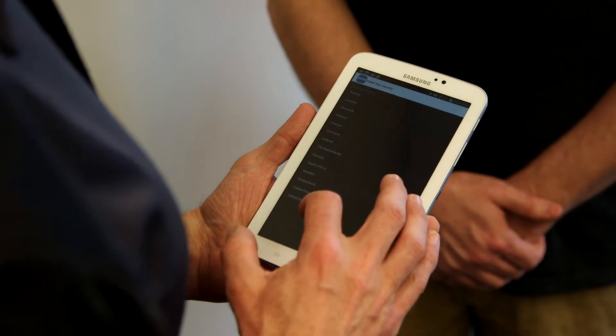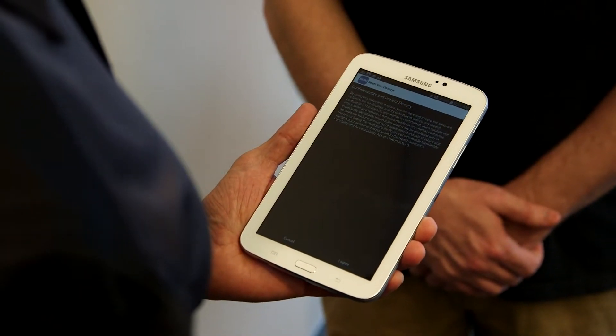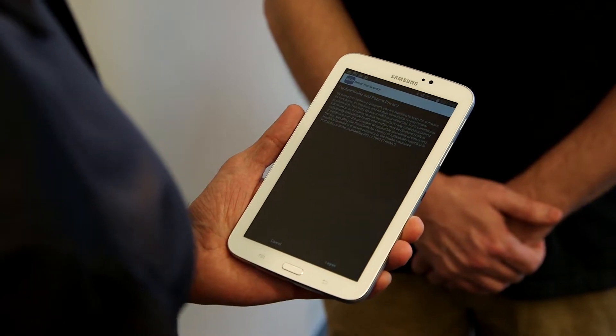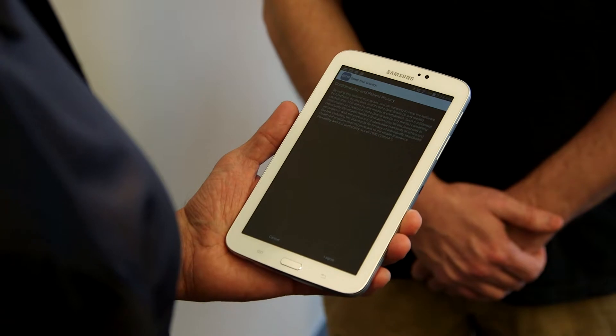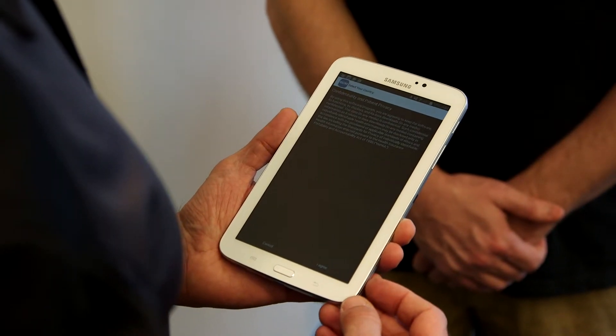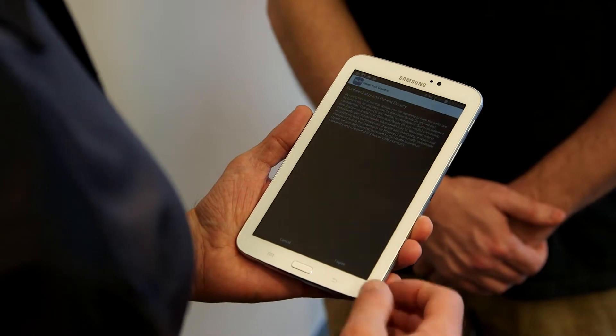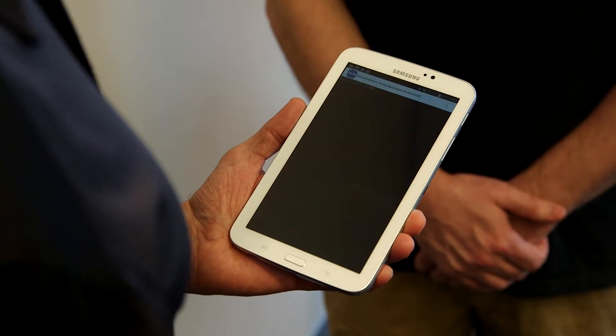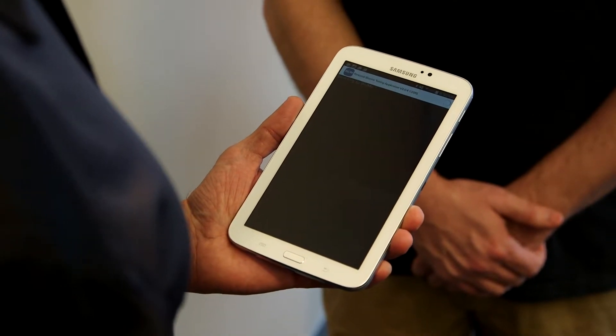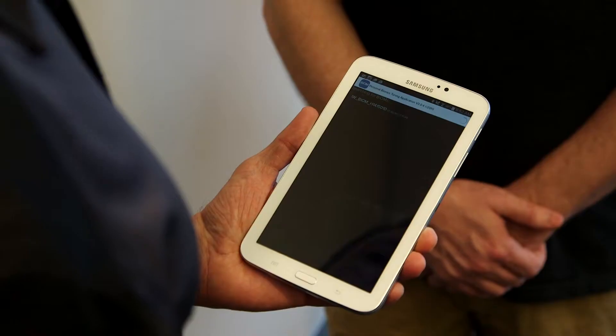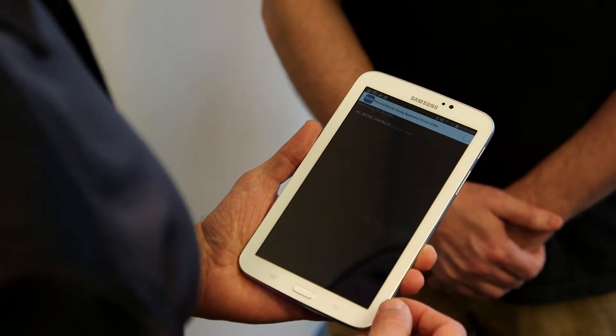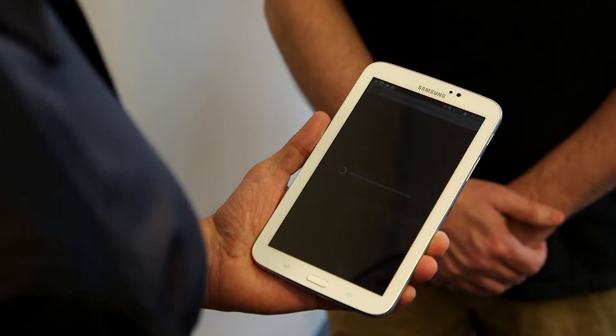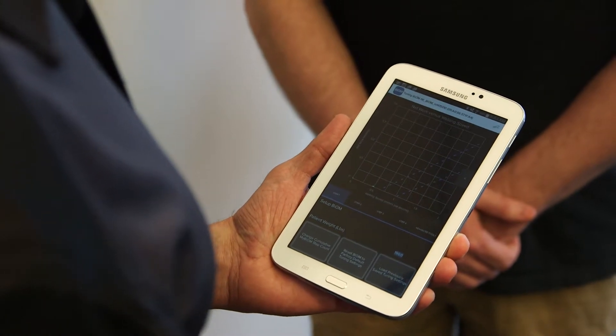At that point, it's going to ask you if you want to change the password. We generally recommend that the customers leave it at 1234 so that they don't forget it. We'll just hit continue in this case, and then that's going to bring up another screen that's going to ask you which country you reside in. There's a number of options for our international clients, but in this case, we're going to choose the United States. Then that's going to bring up the confidentiality statement. This is primarily intended to assure that we meet HIPAA compliance, and really that's just assuring that we're not going to be sharing the information that we collect from the ankle with anybody that's not supposed to see it. We hit agree, and then it will go into a Bluetooth search. This generally takes anywhere from 15 to 30 seconds to identify the ankles in the area, so it will have a 10 meter radius for the Bluetooth search. Now we see Ryan's ankle. This is the serial number of the ankle. At this point, I'm going to choose that in order to log in to the ankle or connect with the ankle. Once we connect, this takes us into the home page for tuning the ankle.